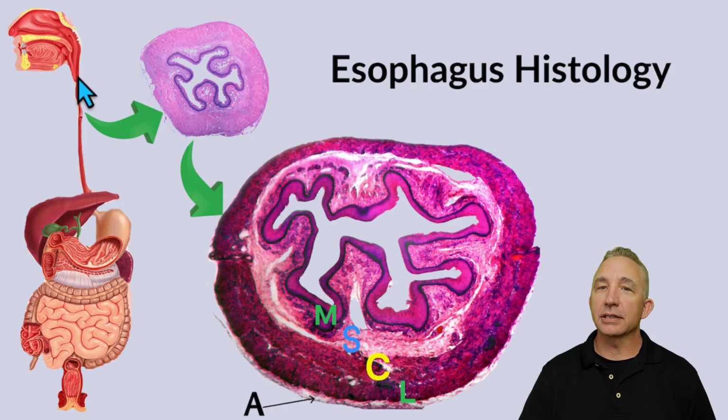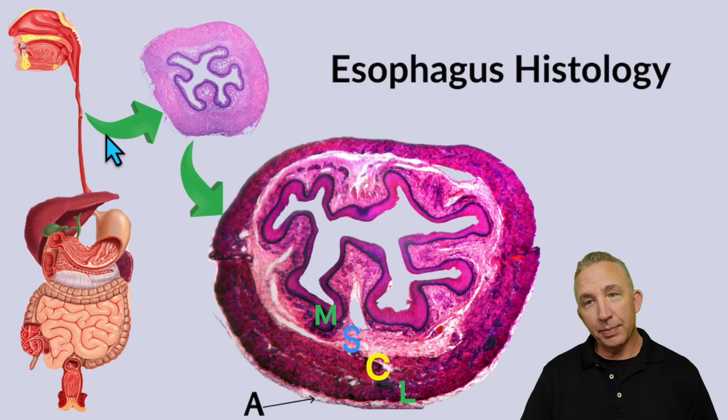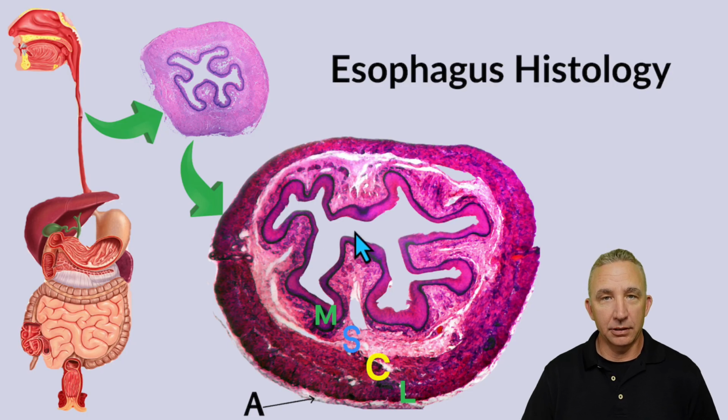And remember, the esophagus is roughly about 10 inches long, and it can be broken down into 3 regions where the neck is at the cervical region, as I go through the chest, the thoracic region, then when I get down to the abdominal region. So 3 regions. But as we open it up and look at it from a histology perspective, I got 2 views here, and we go inside the lumen or the hole to where we have the food that would start to pass down, refer to that as the bolus, but that will eventually expand.